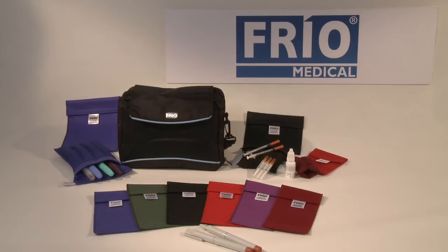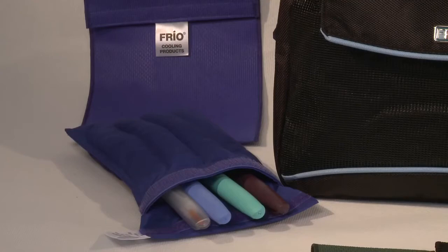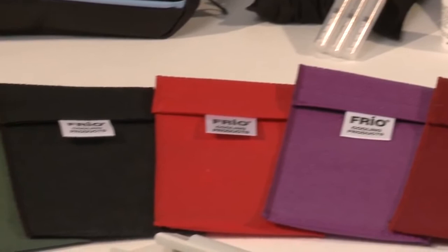The Frio Wallets are available in a range of sizes to accommodate medication in the forms of vials, syringes, pens, pumps, epi-pens and many other delivery devices. They also come in a range of colours.